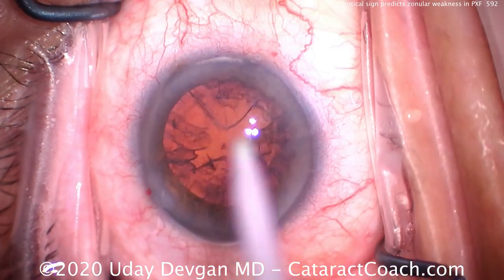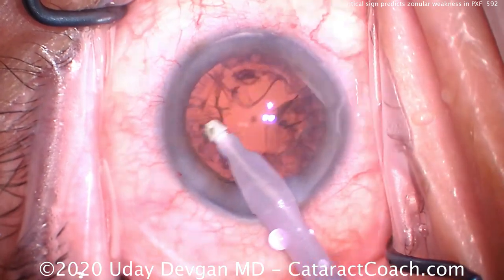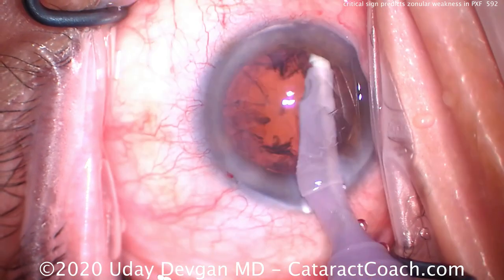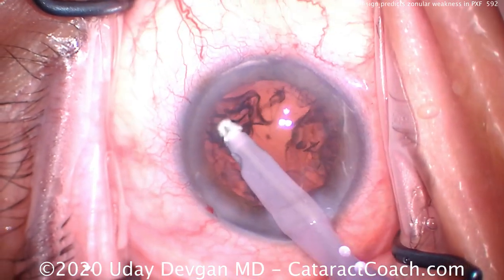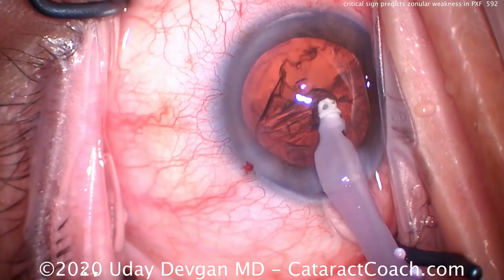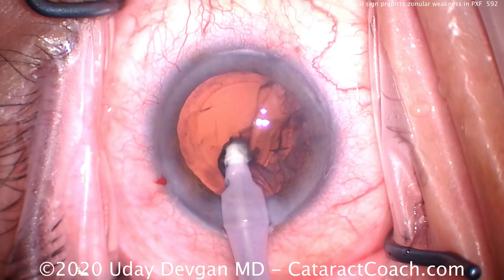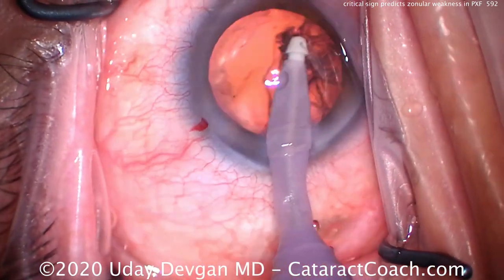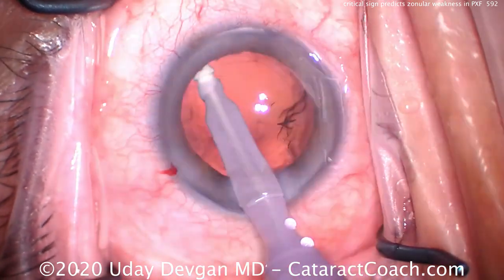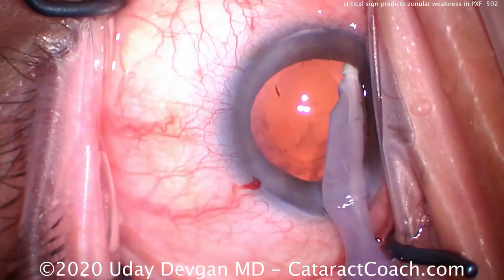In the clinic, if you have the patient lie back into a supine position and examine the anterior segment using your indirect ophthalmoscope for lighting and your 20-diopter lens for magnification, you'll notice the anterior chamber deepens when the patient is in the supine position — again noting weakness and too much mobility of the lens-iris diaphragm due to zonular weakness and laxity.